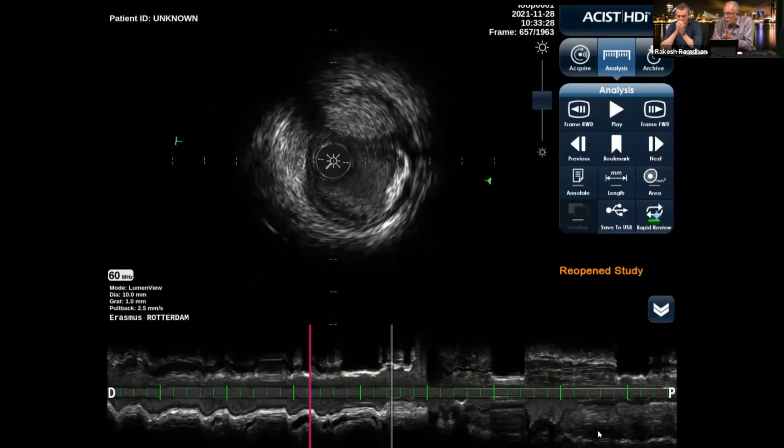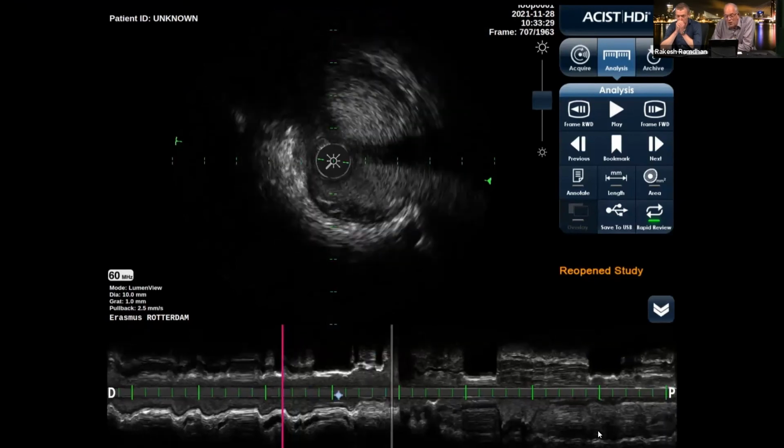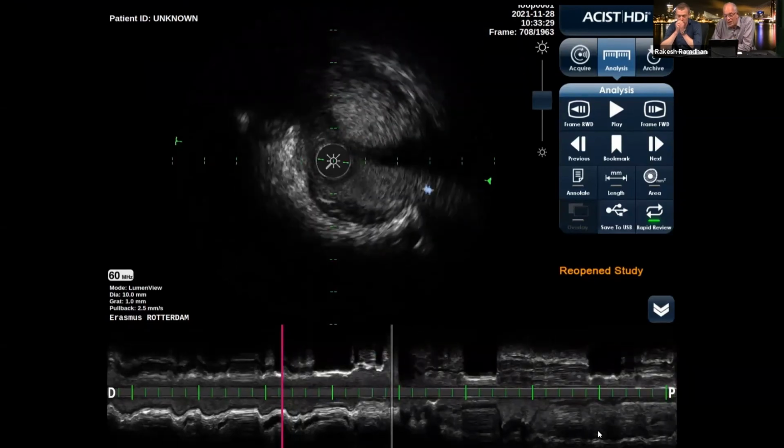Remember that in the first case we had it in the lumen. Now we have this in a false lumen. The blood is there, can't go further away, and is compressing the media, and thus the true lumen. If we go further, then we see that there is a side branch. Side branch always goes in the true lumen, and we see a false lumen with non-moving blood.